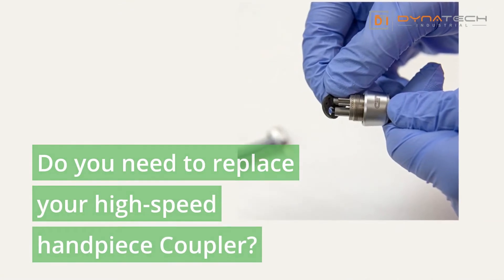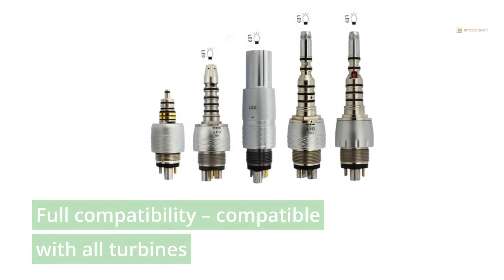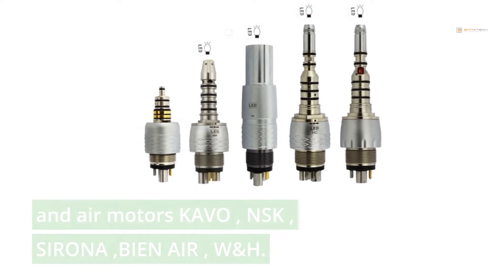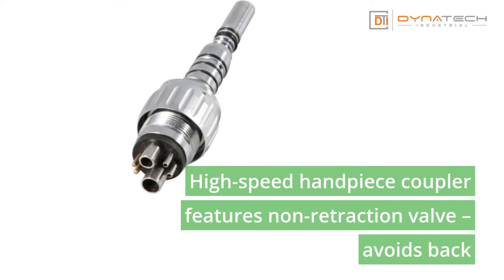Do you need to replace your high-speed handpiece coupler? You are at the right place. Full compatibility — compatible with all turbines and air motors: Kavo, NSK, Sirona, Bien Air, W&H. All couplers have optical connection.